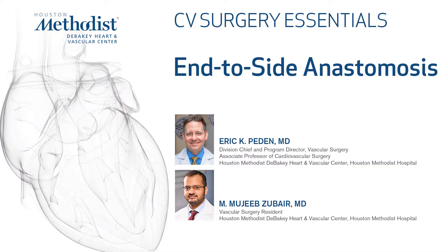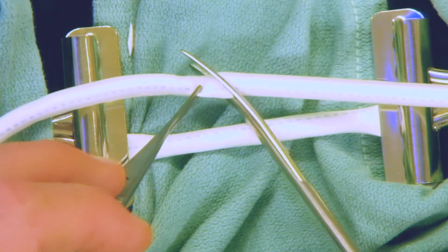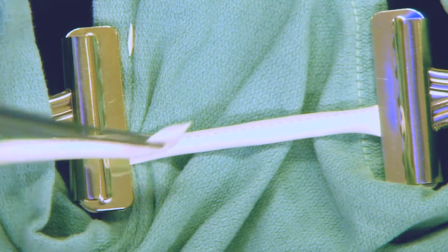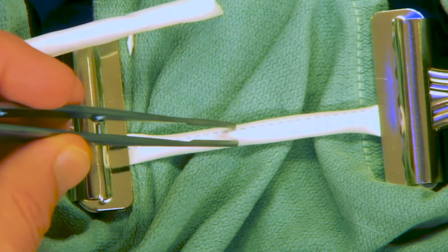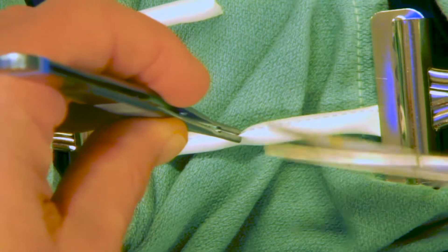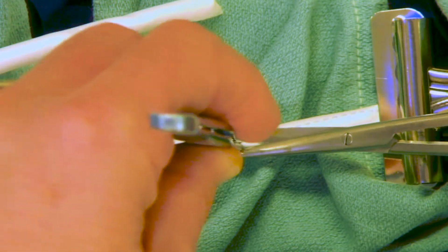This video demonstrates an end-to-side anastomosis using Castro Viejo needle drivers and a 6-0 proline suture. First, we want to prepare our grafts for our end-to-side anastomosis. In this case, we've cut our graft at an angle, and now the graft and the other piece are at a roughly similar length.